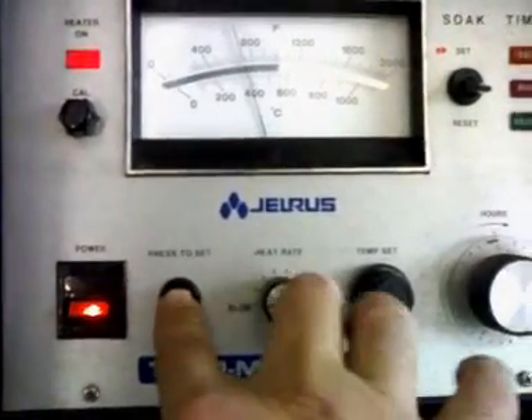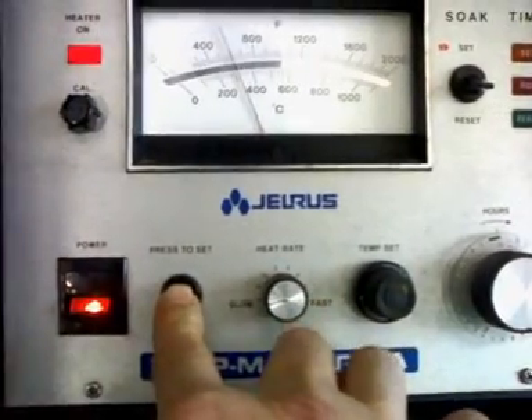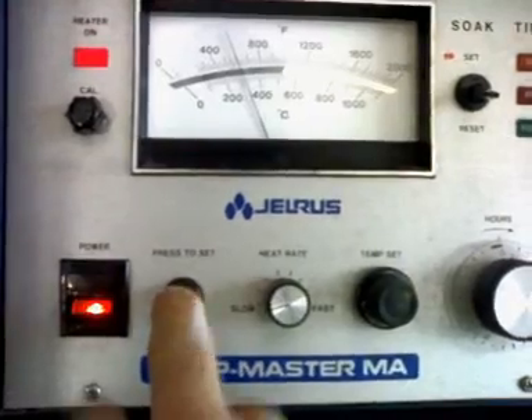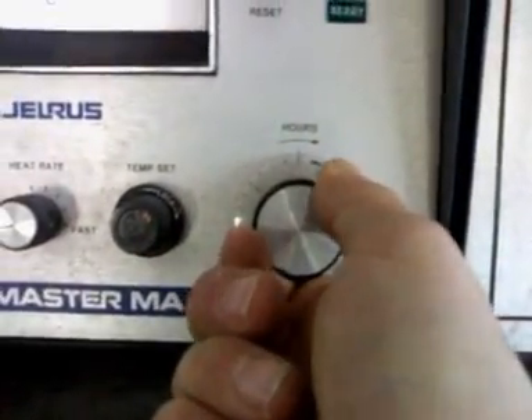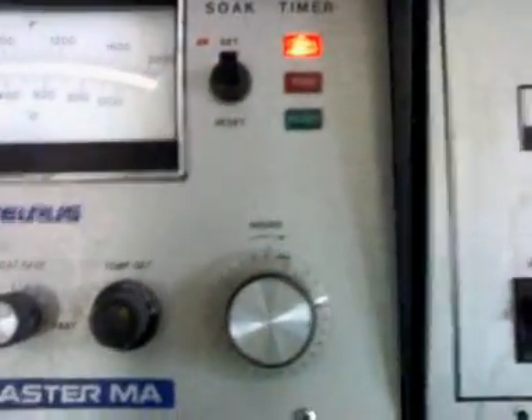Nope, too hot. There we go — check it again. Okay, now we're going to set it for half an hour. When it's ready, the timer will call me. And that's it.